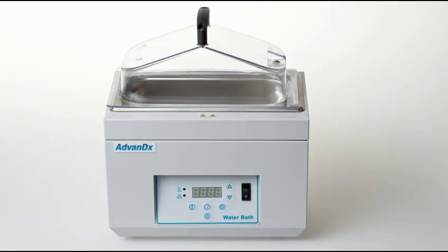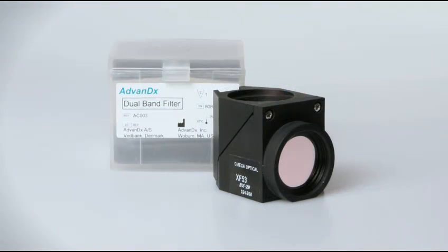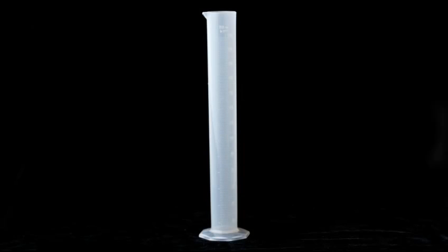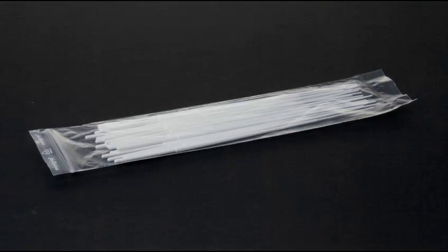A water bath, staining dishes, and a dual-band filter for the fluorescence microscope. Other items required are a 250ml graduated cylinder, a 5ml pipette, and sterile tips.